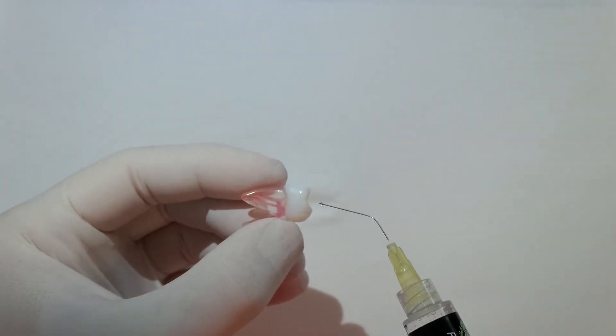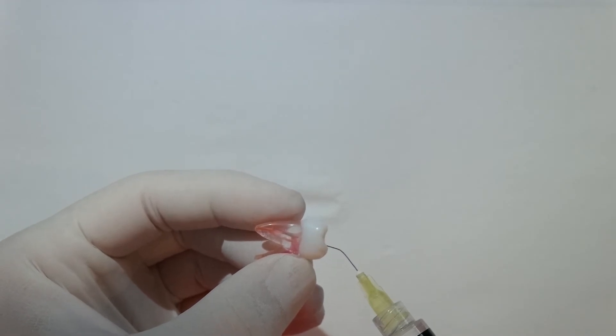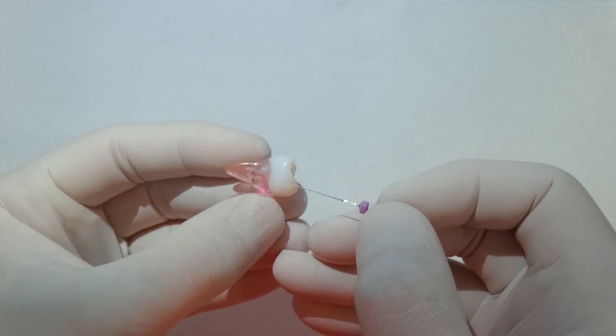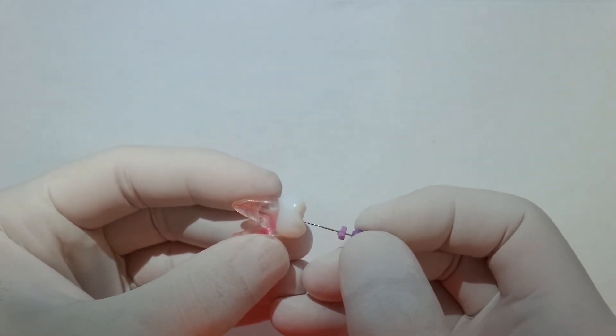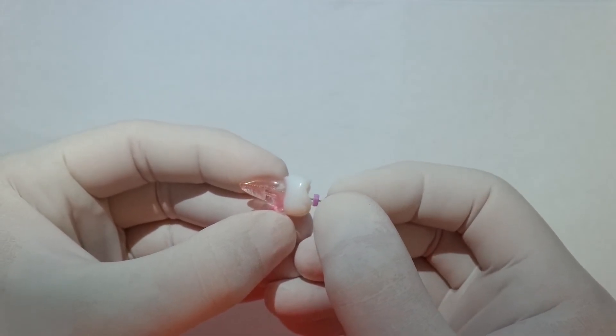Back in with the sodium hypochlorite, and then we'll patency file again just to make sure that's completely free from any blockages, right from the top right down to the bottom. Just bounce that, make sure that's really nice and patent.